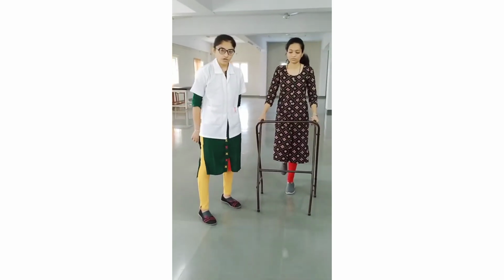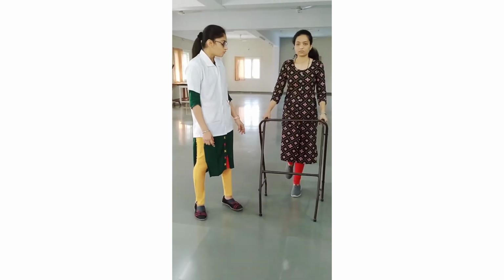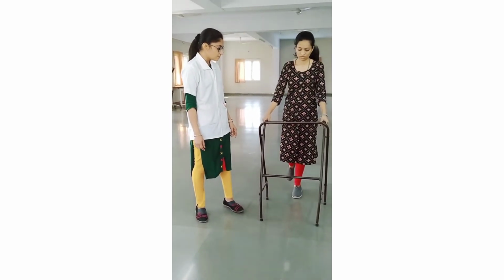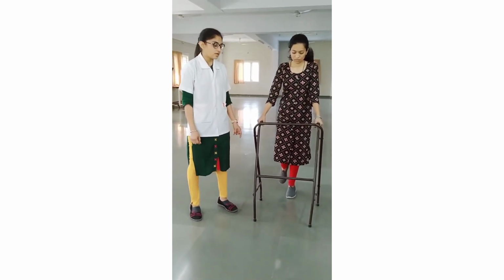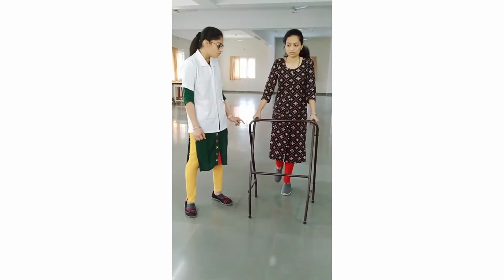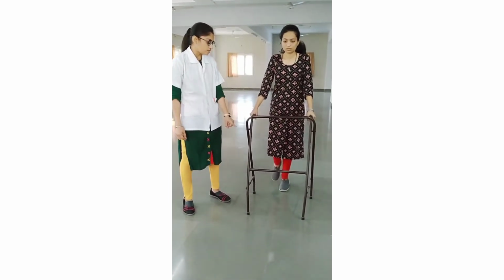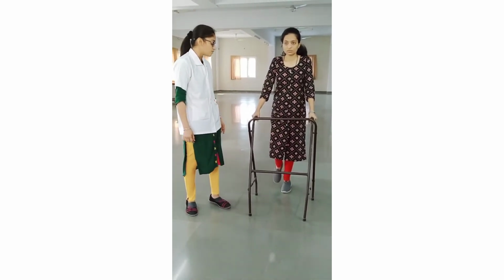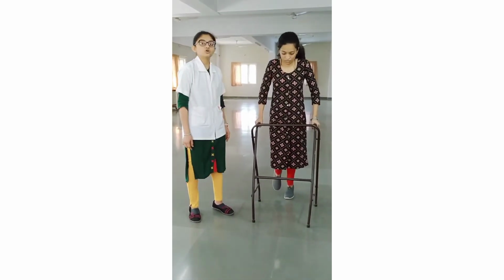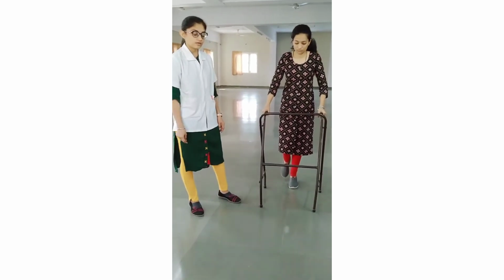Third is the non-weight bearing. Here the patient's right leg is affected. So move the walker forward up to the patient's arm length. The affected limb is placed anteriorly but does not make contact with the ground. Here the weight is transmitted through the upper limb to the walker. The second step is to move the unaffected limb forward. It is also called the 2-point weight bearing. This cycle is repeated.